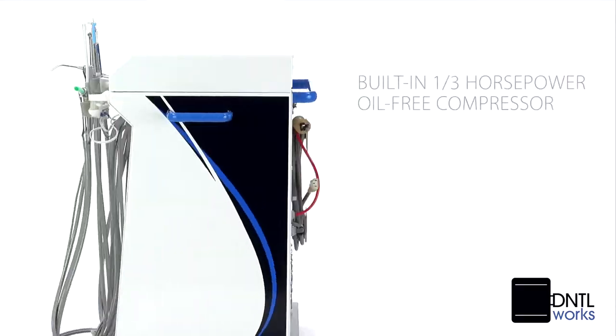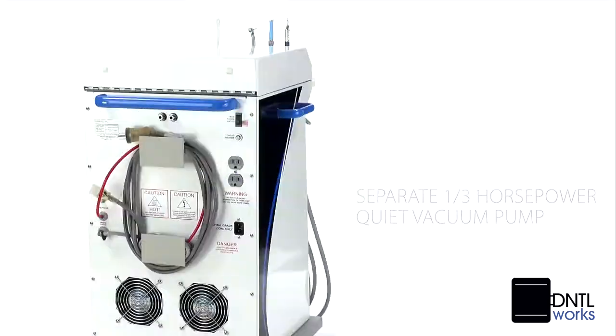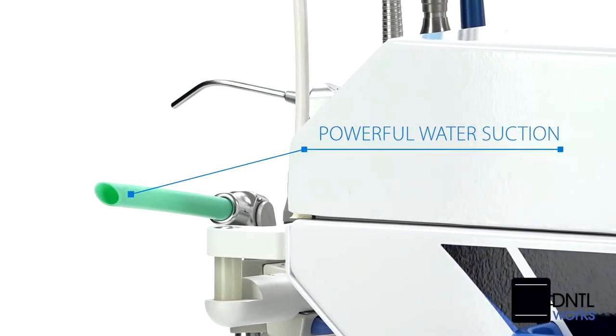Our built-in 1/3 horsepower oil-free compressor and separate 1/3 horsepower quiet vacuum pump provide powerful water suction and waste management.